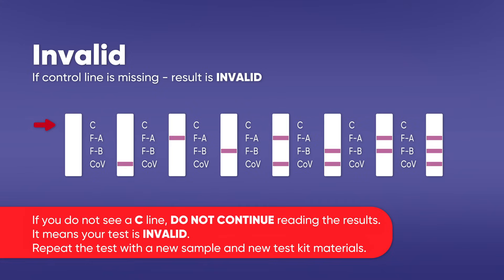Invalid result: Check to see if a pink to red line is visible at the control line (C) in the results window. If a line is not visible at C — even if any other line is visible in the results window — the result is considered invalid. If you do not see a C line, do not continue reading the results; it means your test is invalid. Repeat the test with a new sample and new test kit materials.